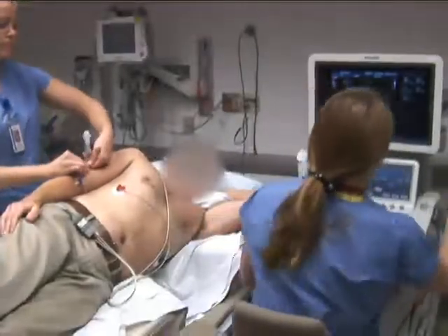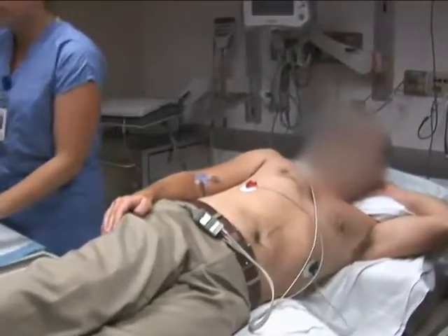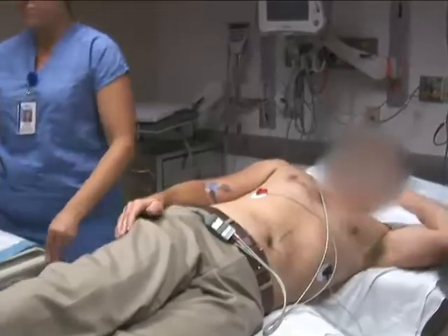When the study is complete, the IV is removed, and the patient is dismissed once the complete echocardiographic study is done.